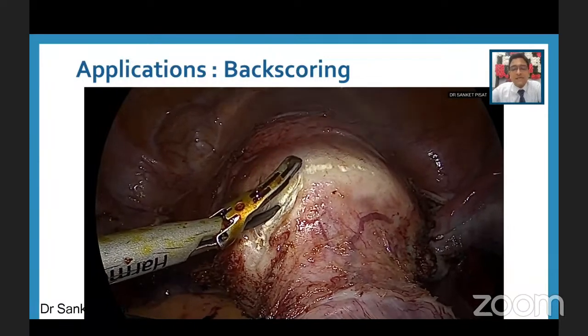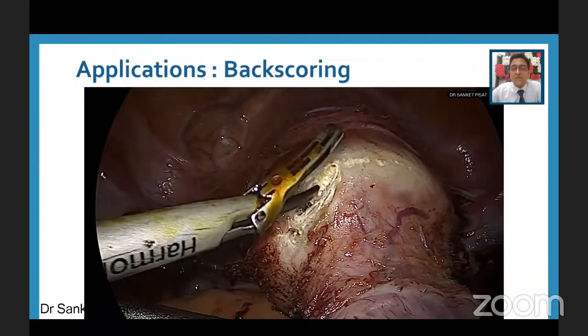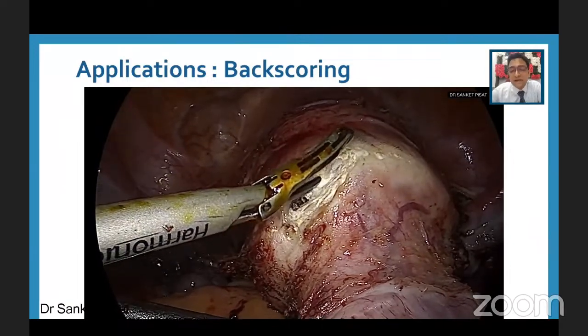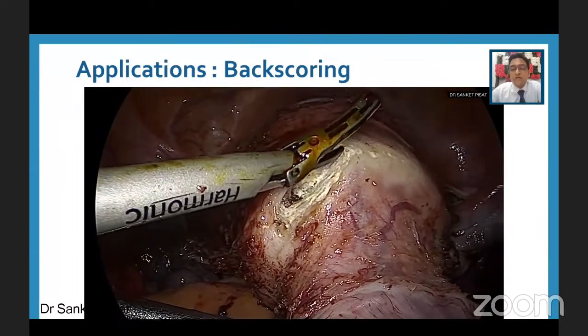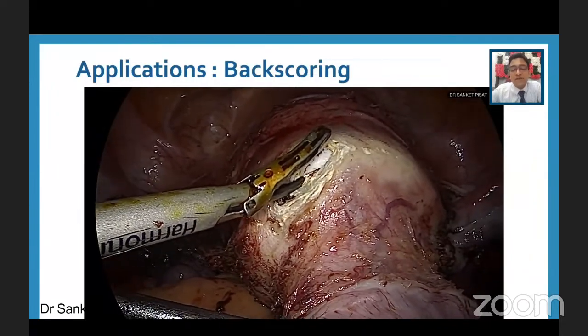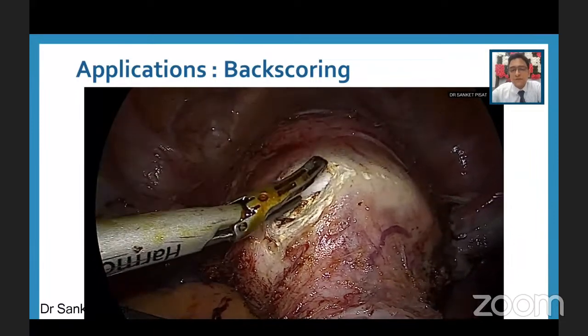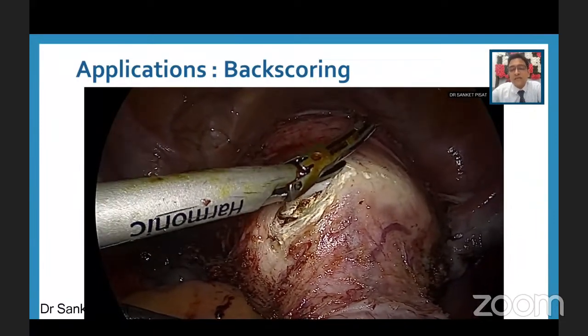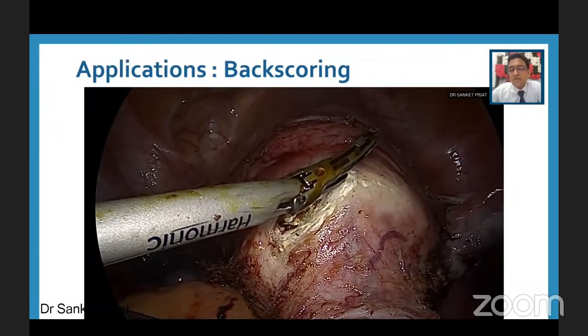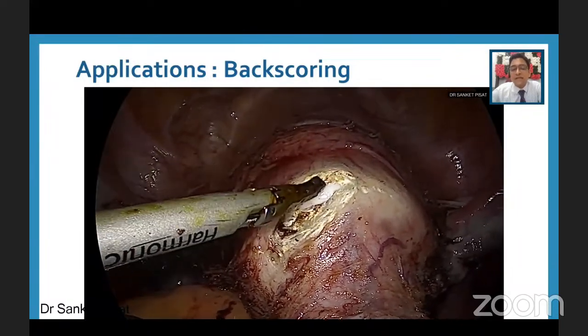This kind of application is used in gynae endoscopy, particularly for the sake of opening the vault in hysterectomy, like I am doing now. So we have put in a ceramic cup or a tube inside the vault, and we are opening the vault over it. So here you can see, without closing the blades, without holding the tissue in between the blades, I have got the action of a cutter with just one single blade.